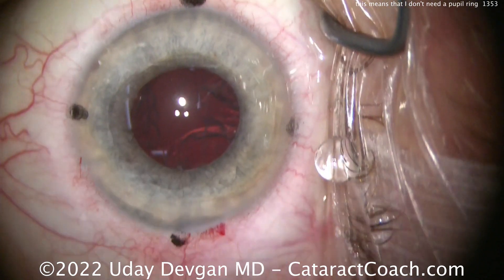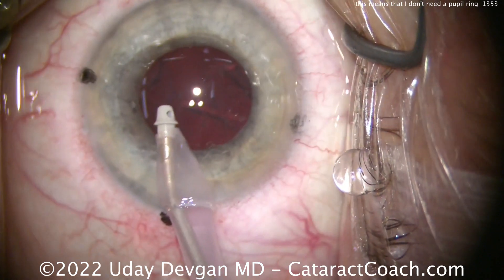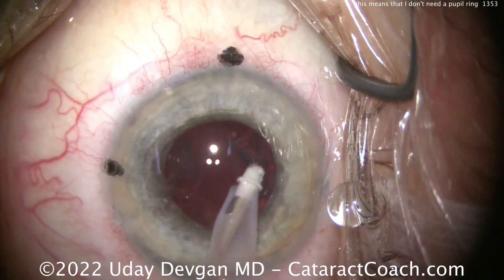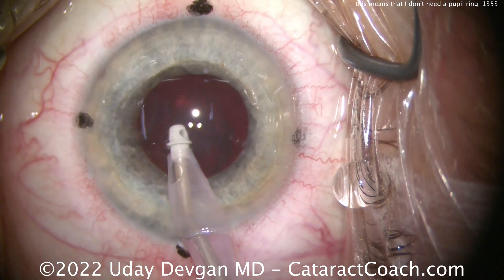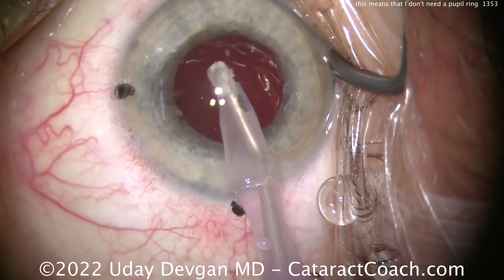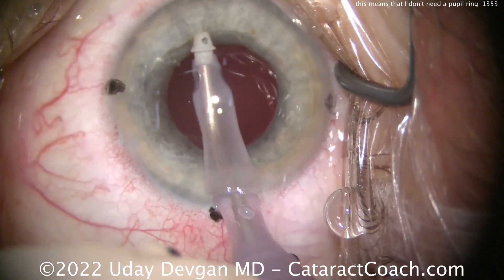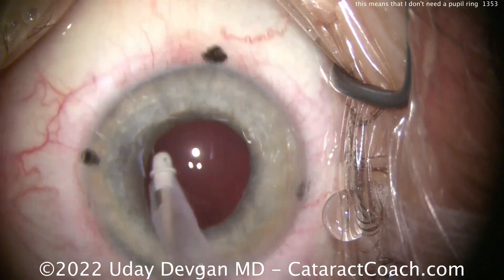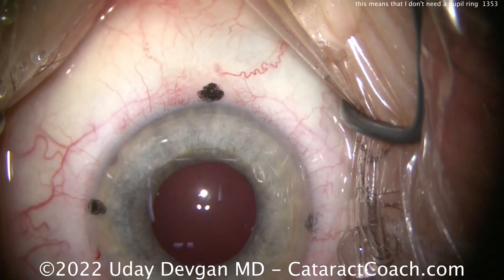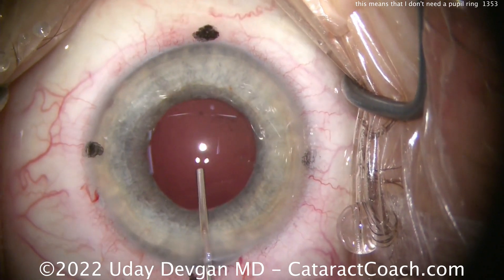We've also marked off the cornea at the correct steep axis, in addition to those black marks for the cardinal meridians, and that's going to help us place our toric monofocal IOL in the capsular bag. This patient was previously hyperopic and had hyperopic LASIK, which I'm not a huge fan of, because it creates that small optical zone and that very steep central cornea. In this case, we are going to put in a monofocal lens — I'm not a big fan of using a diffractive or trifocal lens in a patient who had a couple of diopters of hyperopic LASIK, as the cornea has too many aberrations which will confound things with that trifocal.